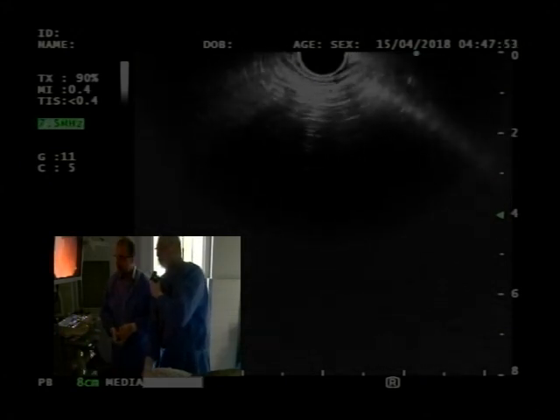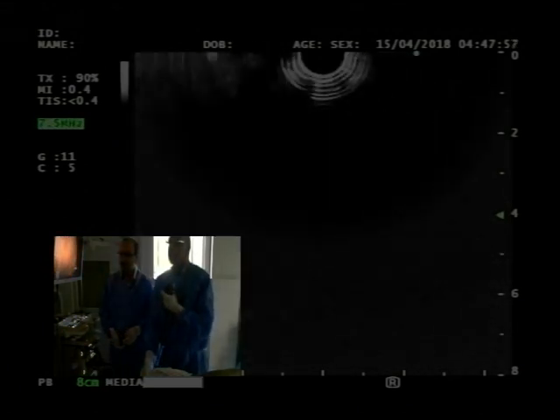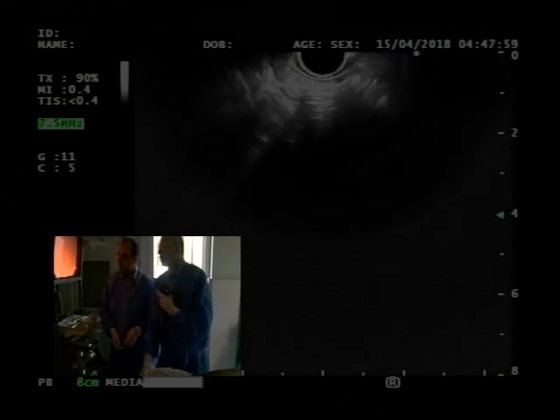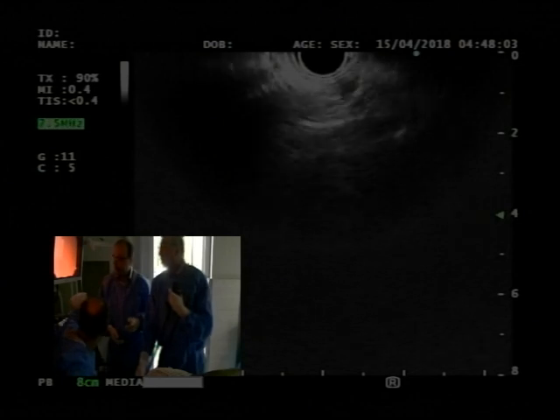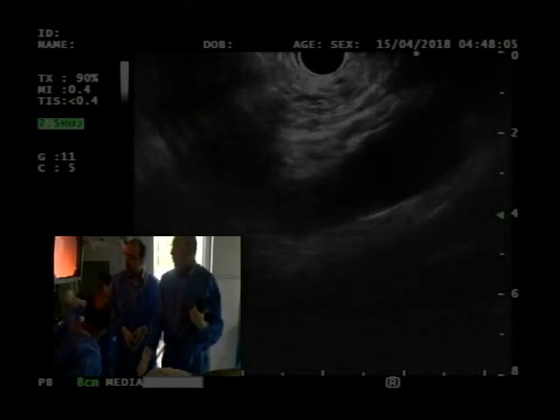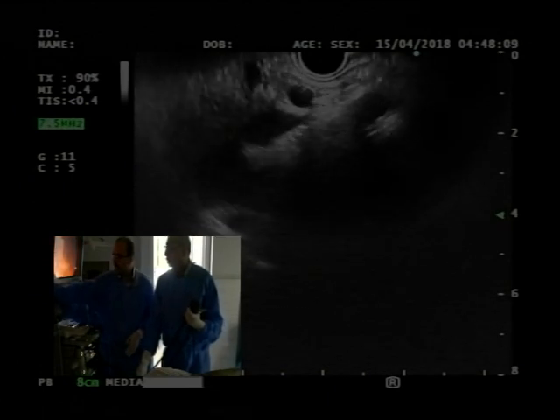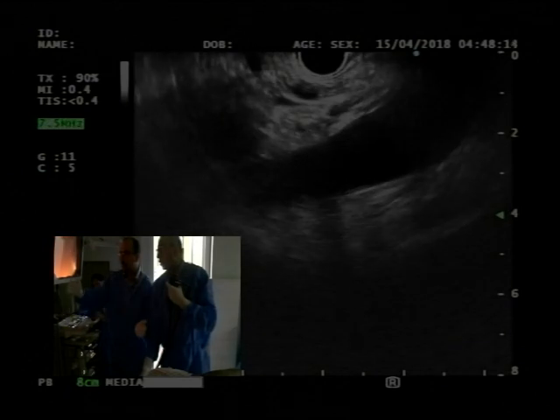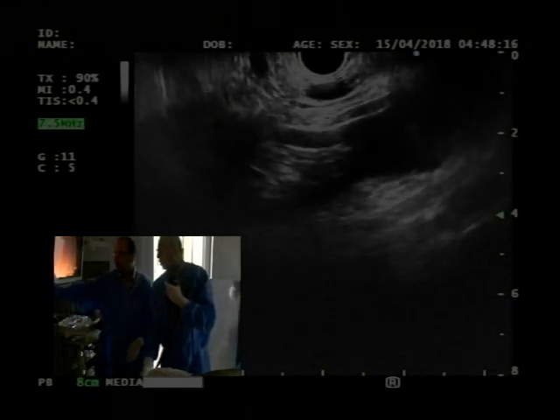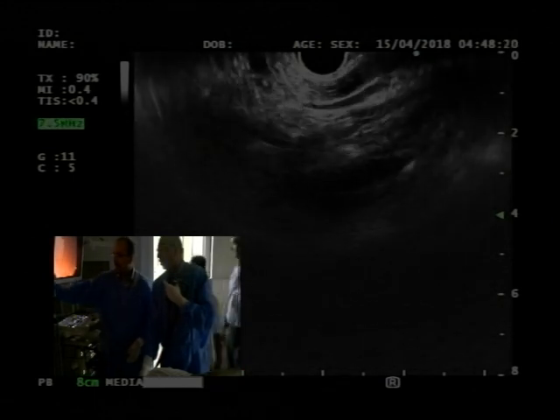Okay. And there is air, this is an artifact here on the left. Go counter a bit, other way. So now you're seeing structure. So they're somewhere in this area, right? Yeah. Okay, now you know that you have to move in this zone. So now you're starting to see a large structure giving off a vessel.